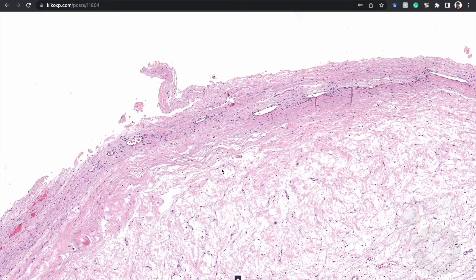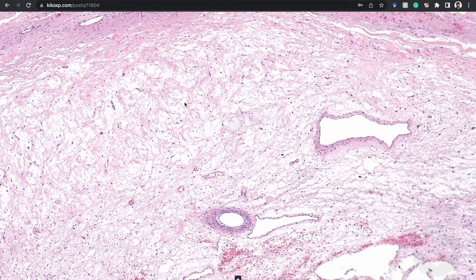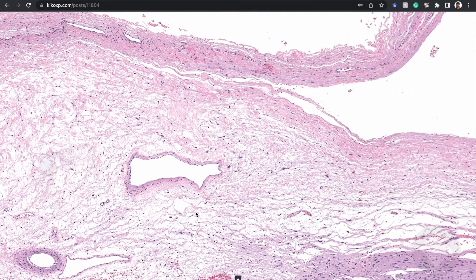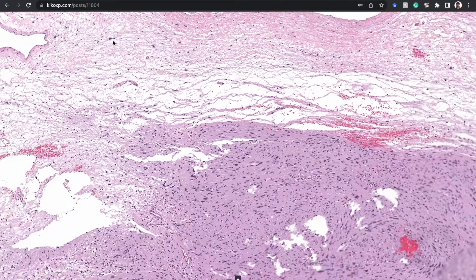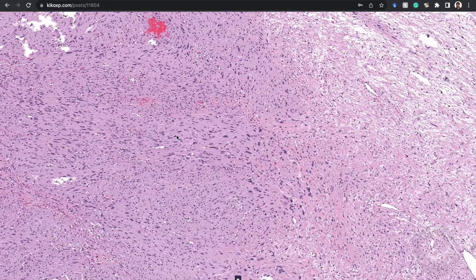You may notice I haven't mentioned Verocay bodies yet — I'll get there. Just like giant cell tumor of tendon sheath sometimes doesn't have giant cells, we have to learn all the other subtle features for those cases. The same goes for schwannomas: sometimes palisading is very subtle or even absent, especially in needle biopsies of deep soft tissue or retroperitoneal schwannomas. In those cases, you must know the other features.